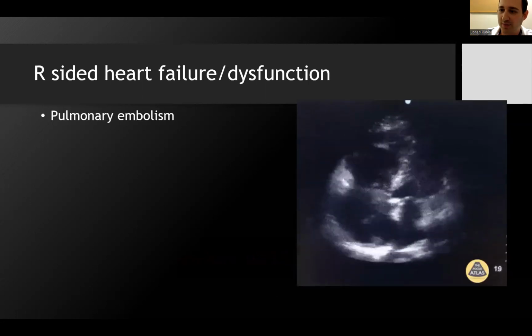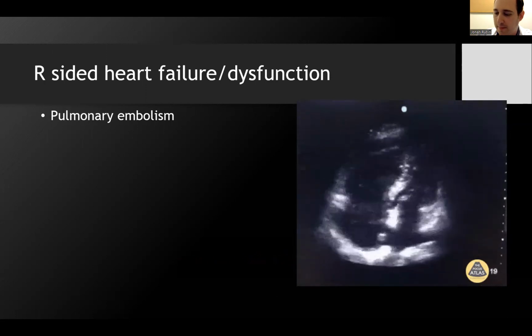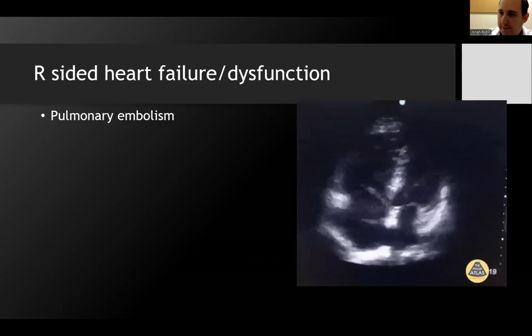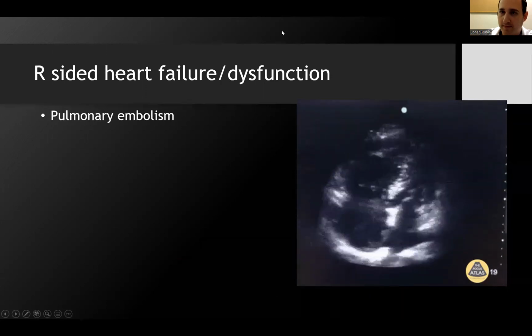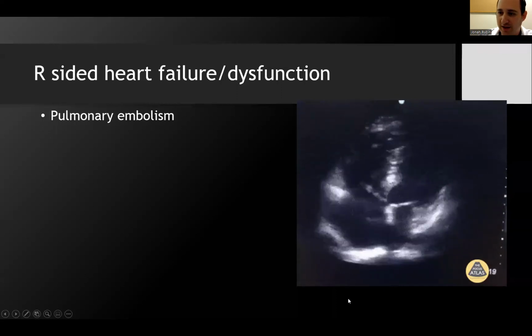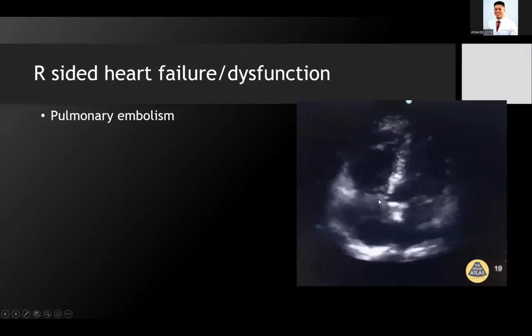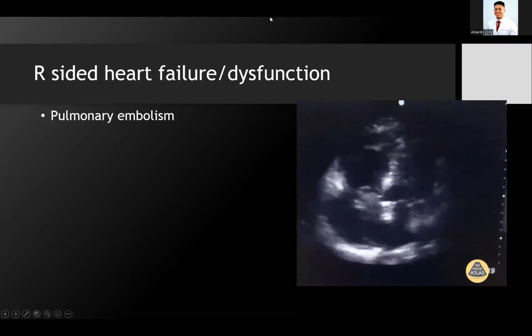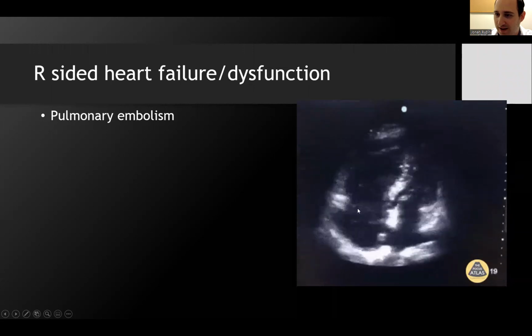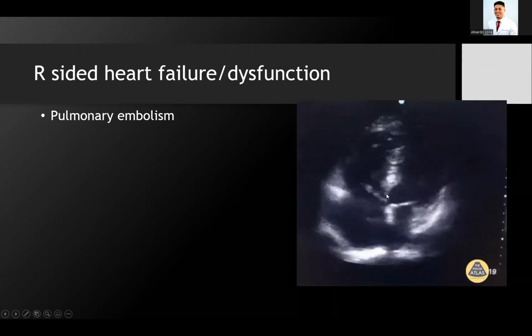So it could be a pulmonary embolism. Anything on this echo that might tell you that this is or is not a pulmonary embolism? It's not the greatest quality image. But something seems to be coming in and out of the RA into the RV. Yeah, you have something spinning around in here, and then occasionally you're seeing it here. You've got a clot in transit. And if you have acute RV failure and a clot in transit, you're done.